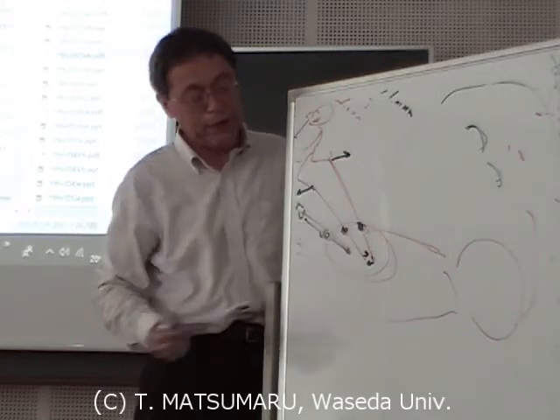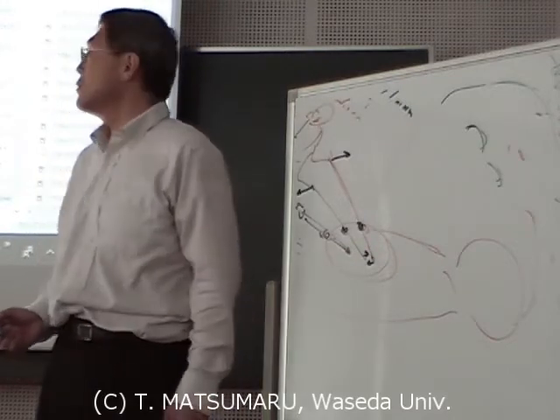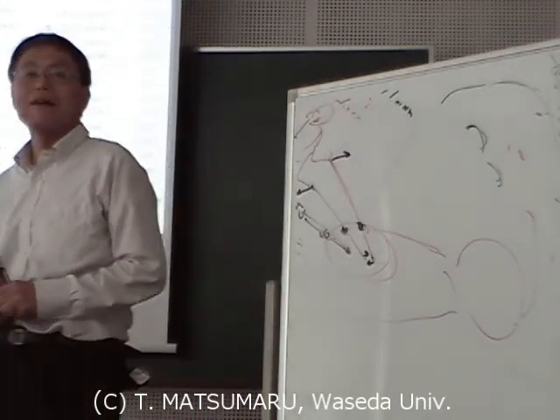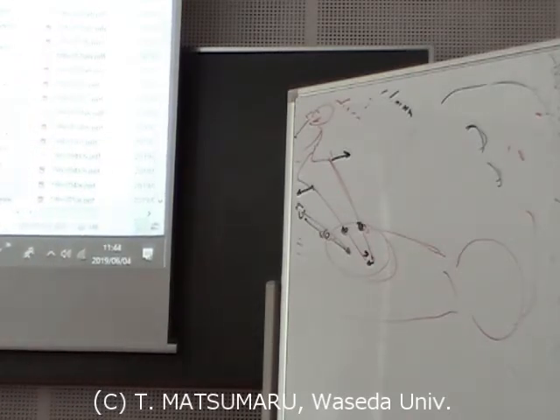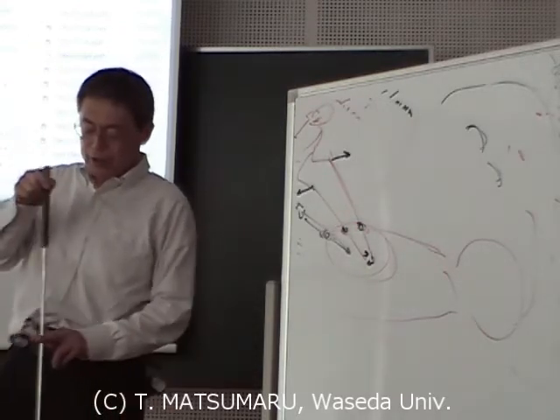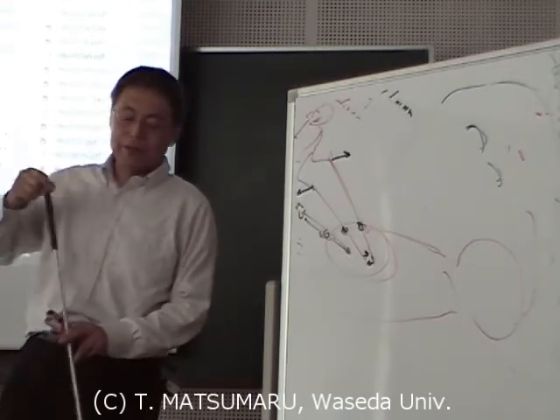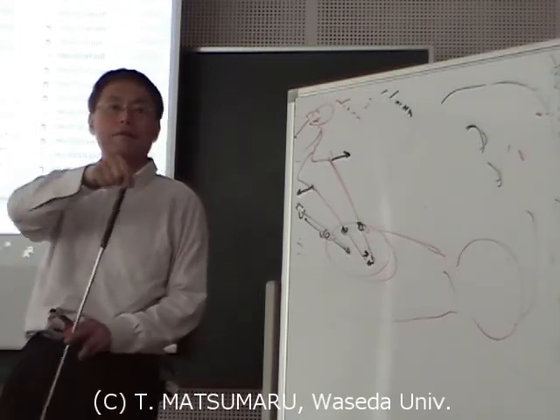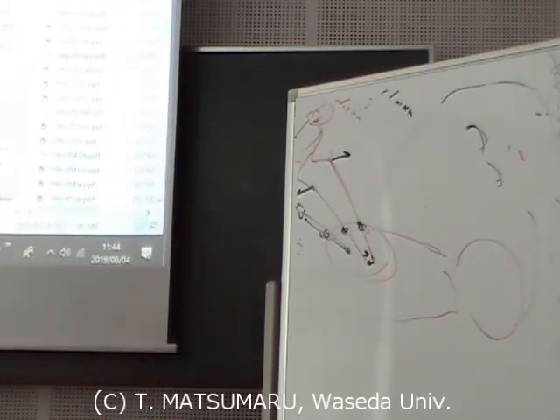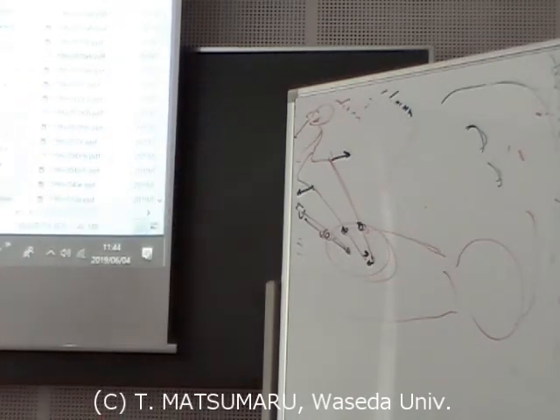It is not a good operating condition. I think this is unpleasant. This is the pivot point, and around this pivot point the operation is moved. For the opposite direction, the surgeon must move. It's not good. Some skills or useful training is necessary.